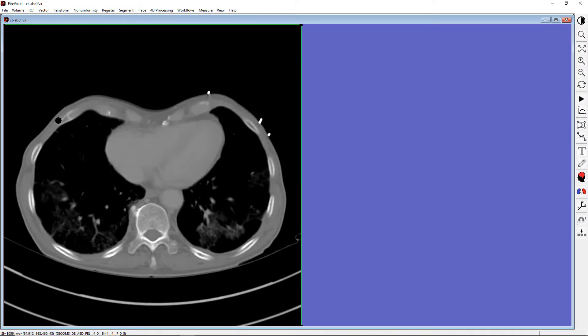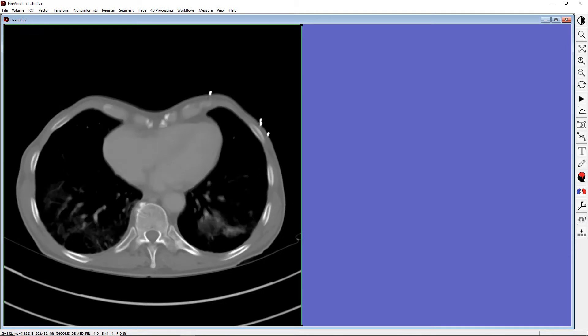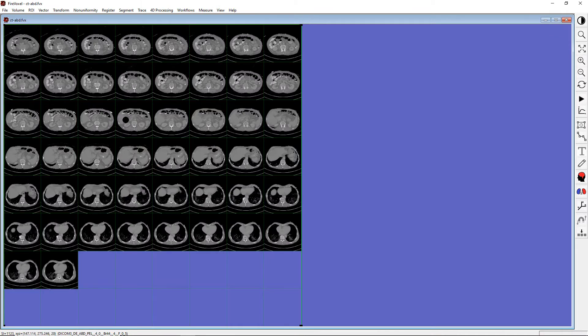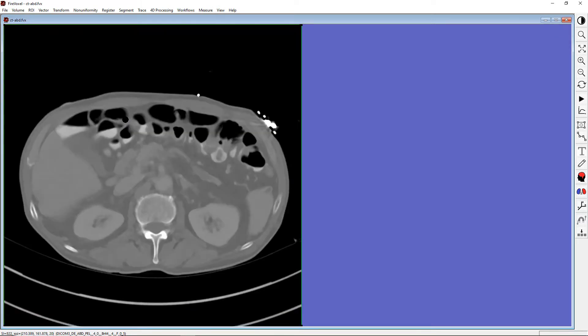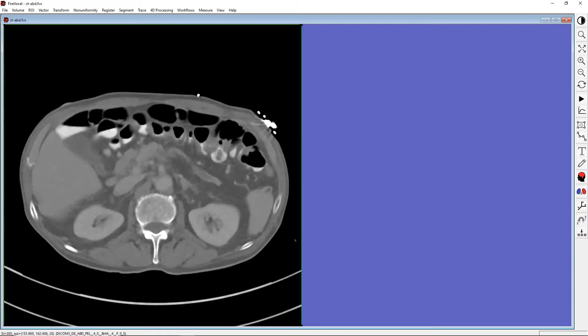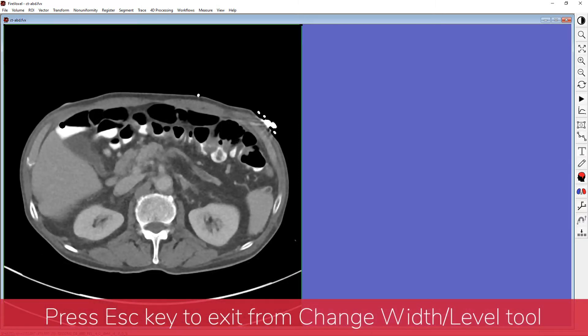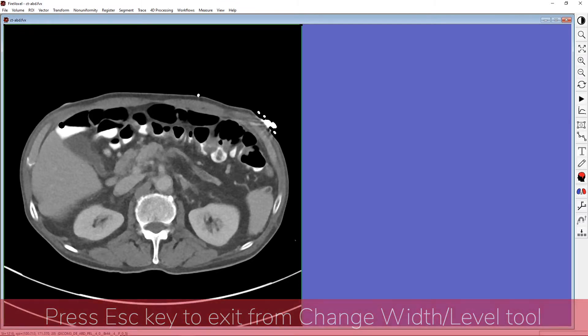When you are using this tool, you can scroll through the slices. Let's select a slice through the abdomen and adjust the window for soft tissue. This will require a lower level and a narrow width. When you are done, press ESC key on your keyboard to exit from this tool.